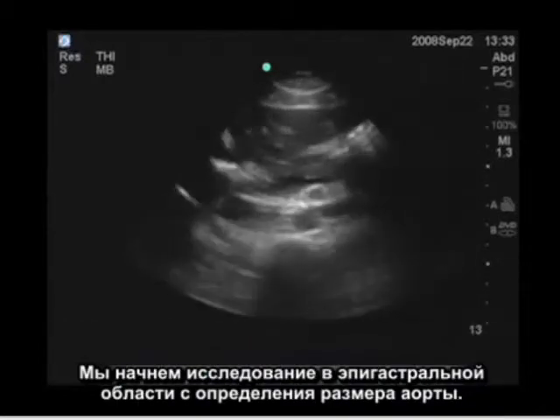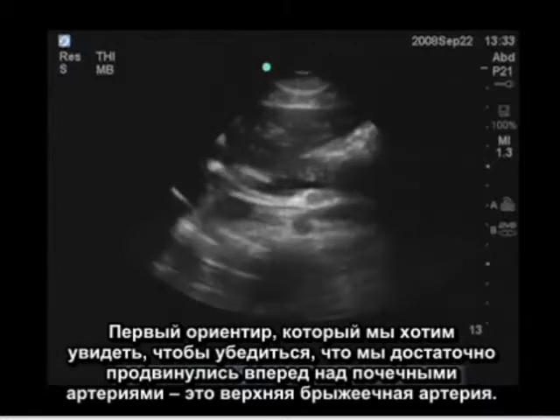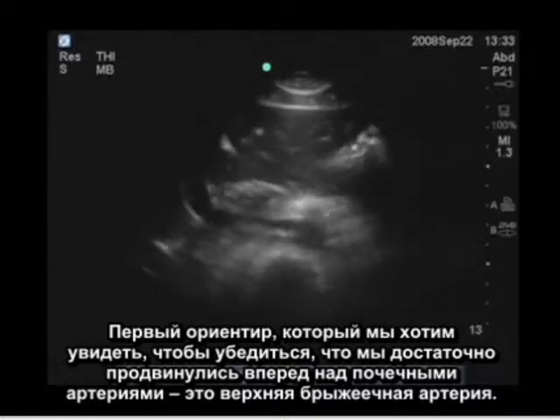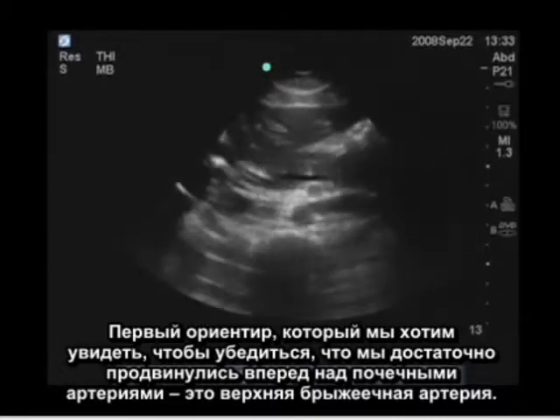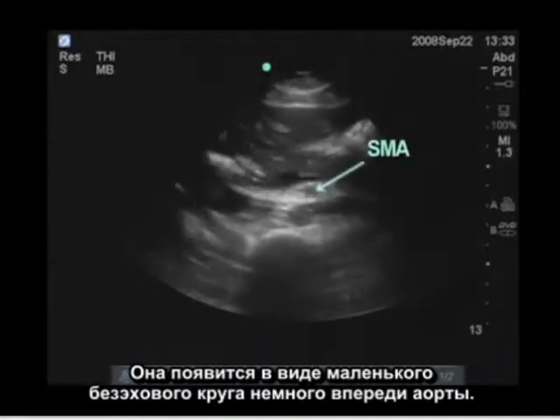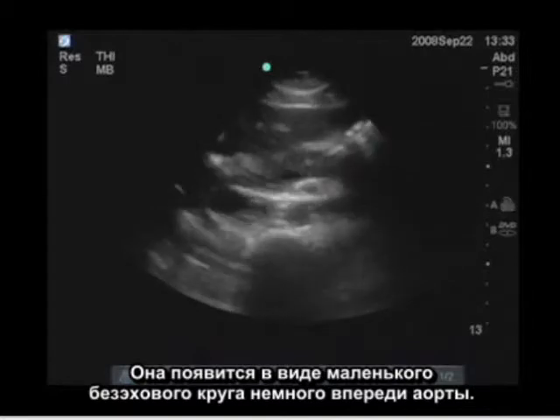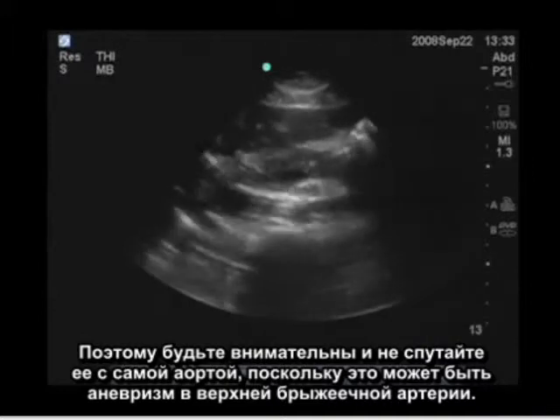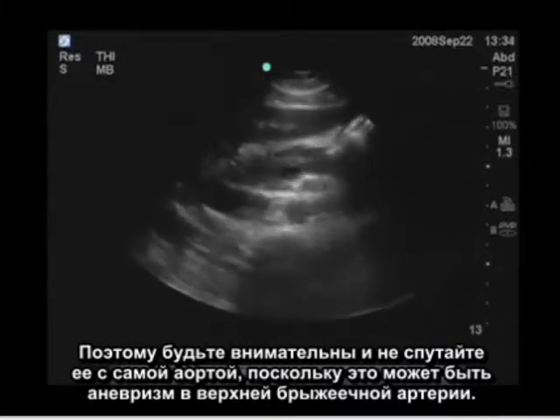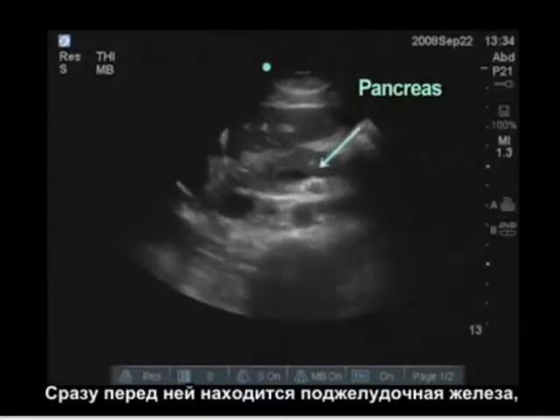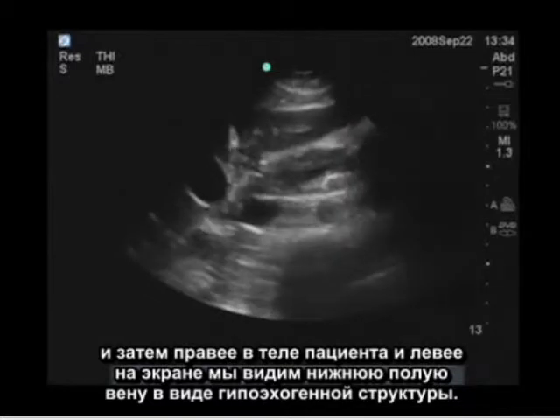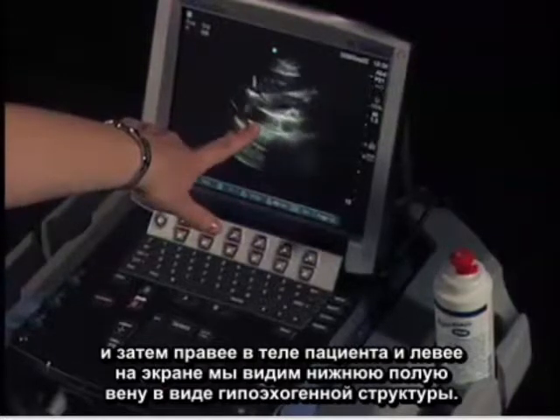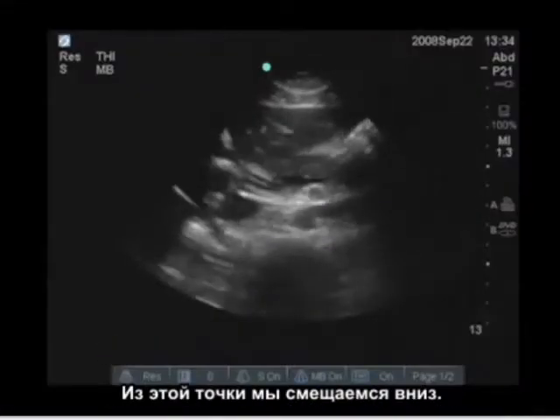We're going to start in the epigastric area assessing the size of the aorta. The first landmark we want to see to know we are superior enough above the renal arteries is the SMA, which appears as a smaller anechoic circle just anterior to the aorta. Be careful not to mistake it for the aorta, as an aneurysm in the superior mesenteric artery is also possible. Immediately anterior to this is the pancreas, and to the patient's right — on the left of the screen — we see the IVC as a hypoechoic structure.